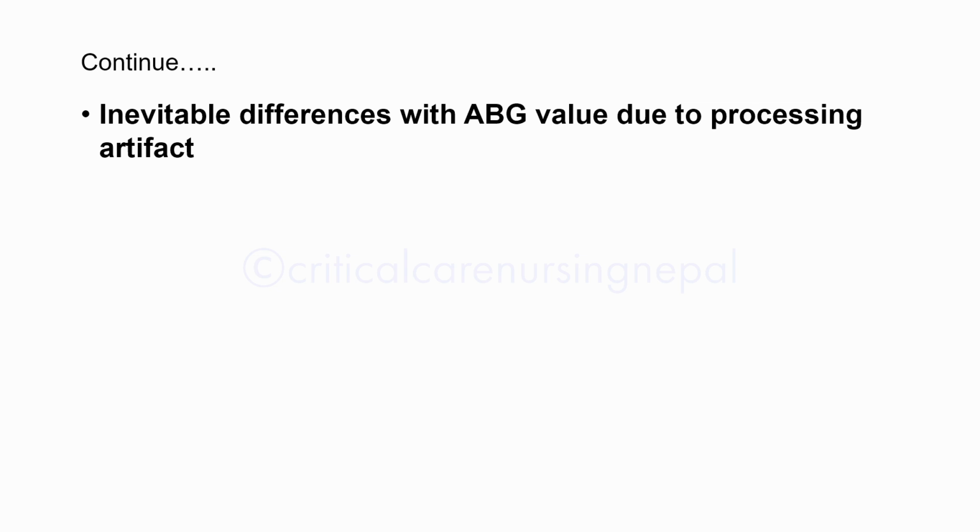There is a difference of plus or minus 2 to 3%, which is expected, but larger differences might indicate a problem. If you see a discrepancy between the ABG SaO2 and the SpO2, always trust the ABG, but also ask why they disagree. Mostly, the answer is a physiological or technical problem that needs fixing.